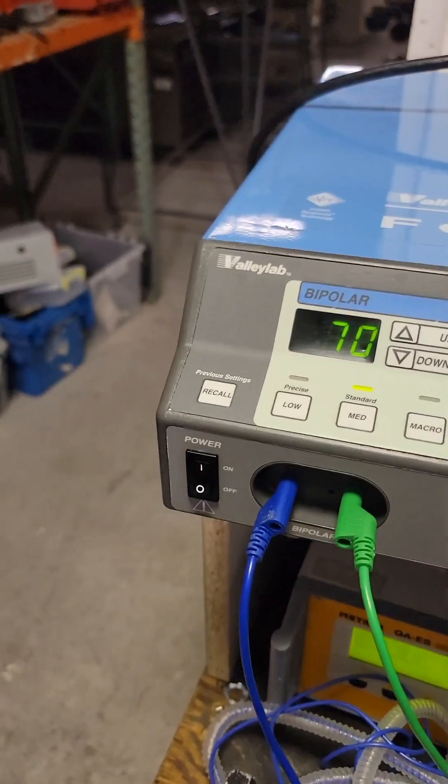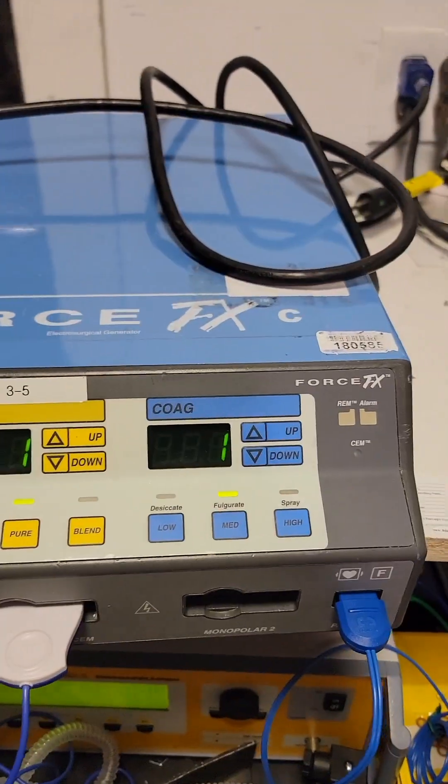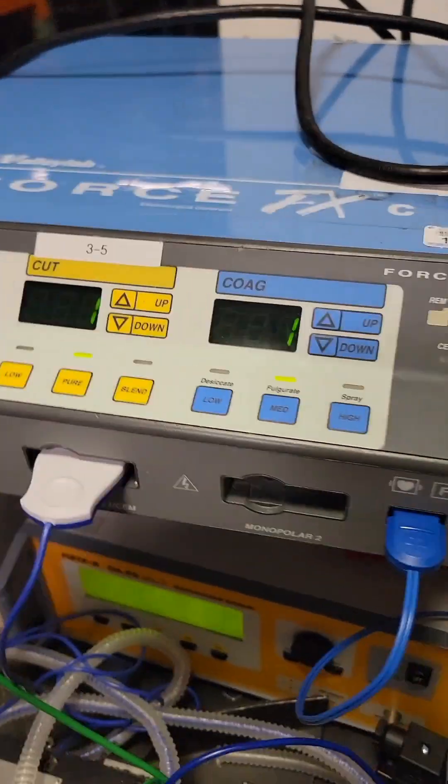How to test an ESU, specifically the Valleylab Force FX, FXC, FX8, etc.